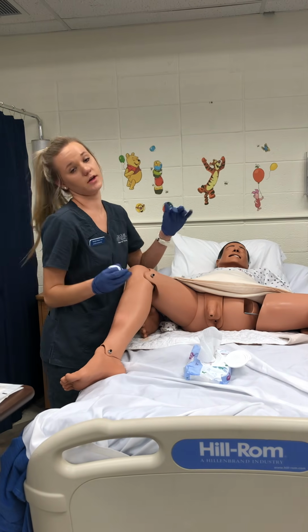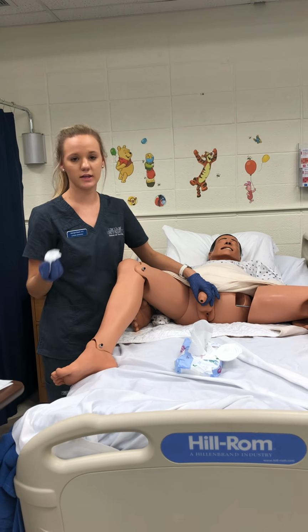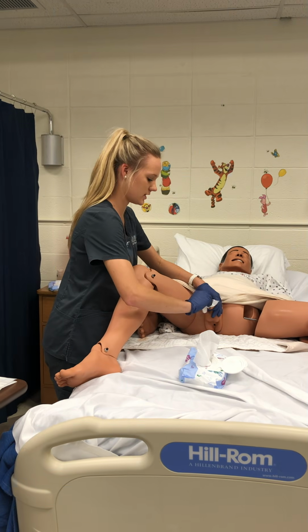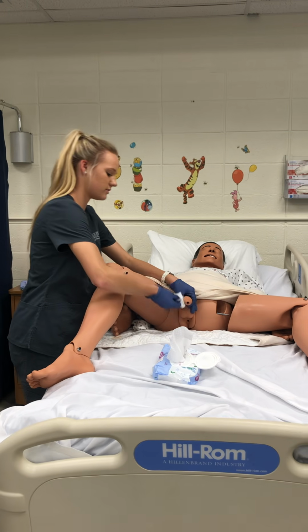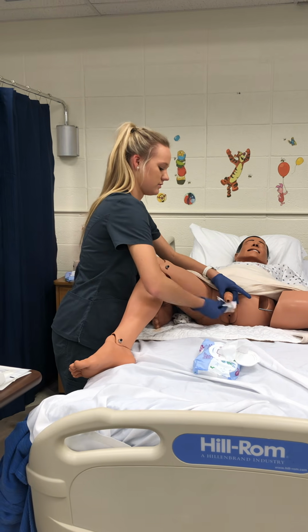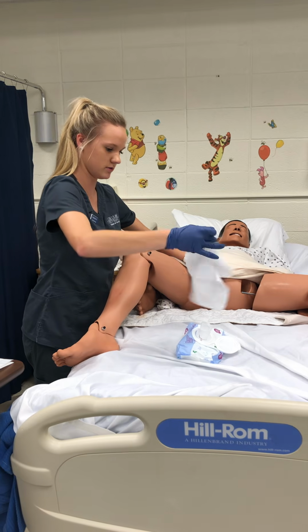So if my patient was uncircumcised, I make sure to pull back the foreskin before cleaning it, and then put the foreskin back at the end of the catheterization and cleaning. So I'm going to start by taking my clean wipes and starting at the top of the urinary meatus and doing a circular motion all the way down. I'm going to do it 3 times. Mr. Jones, are you doing okay? Good.